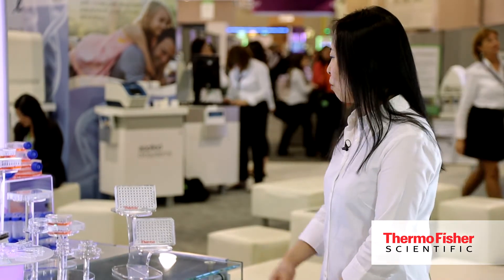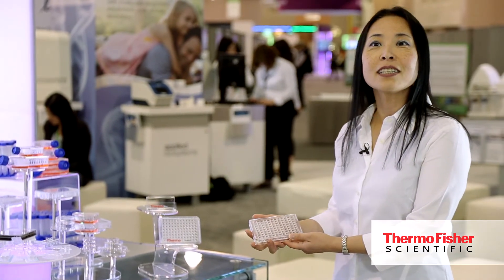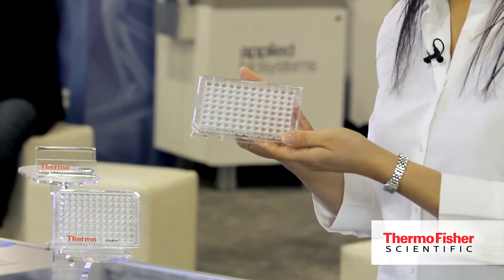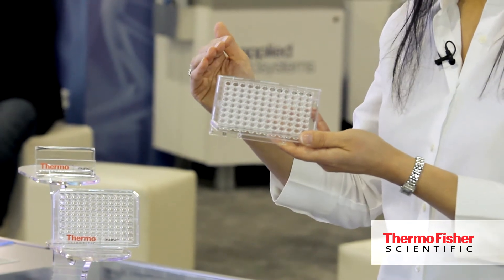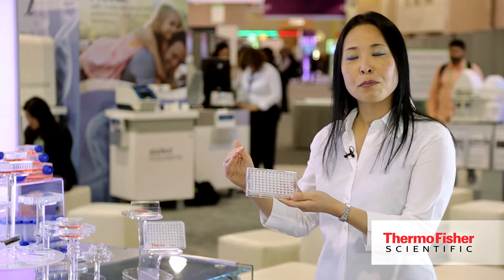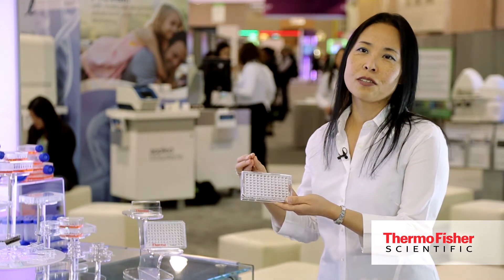For example, we have this Nunc Sphera product line that has been recently launched. It has a super low binding surface that allows people to grow three-dimensional cancer spheroids. The surface repels cell attachment and encourages the aggregation of cancer cells.